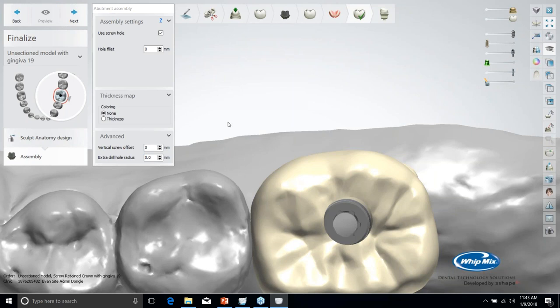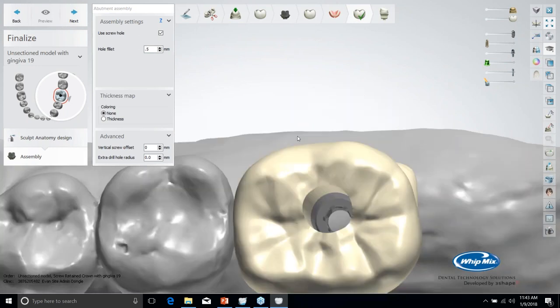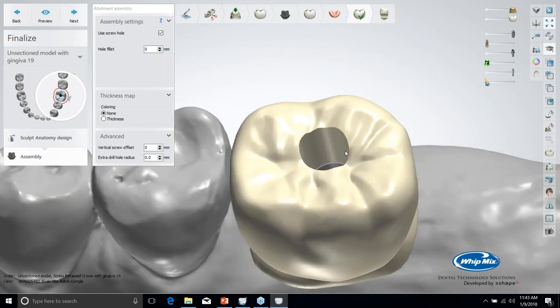And then the hole fillet, all that does is roll the edge of your screw hole. And it would look like that. Might not work in this version, but you would just get a softer edge here.